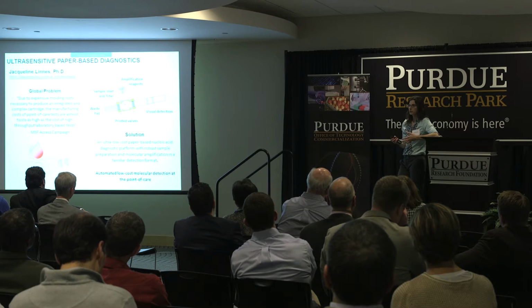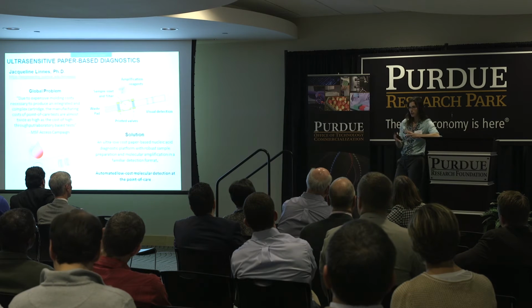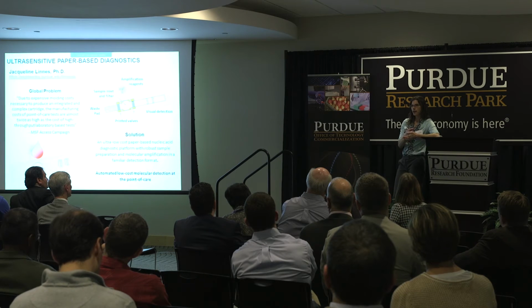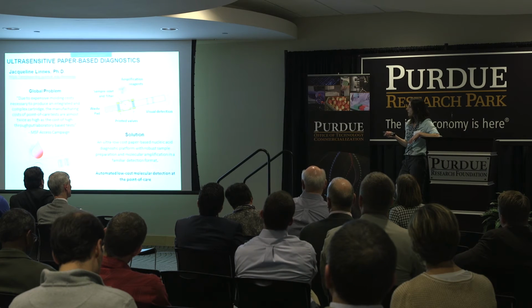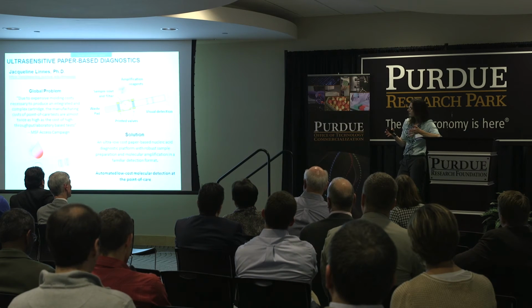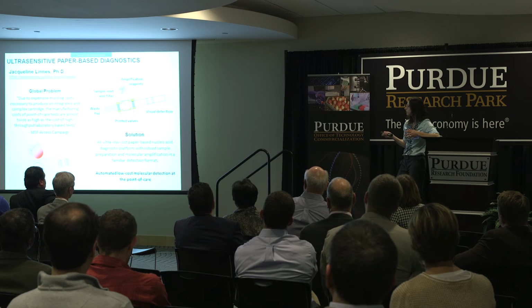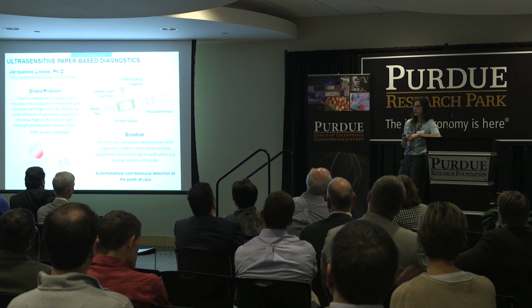Nucleic acid amplification requires you to capture your pathogen of interest and then incubate and hold that reaction there for about 30 minutes. Sometimes longer. We've gotten it down to 15. But you can't just have a lateral flow assay that just flows the whole time. So we have printed wax valves that stop the fluid. And then when we want to start the fluid flow again, we can heat them, and they open to allow the fluid to go downstream to a lateral flow test, which is as easy as detecting on a pregnancy test.